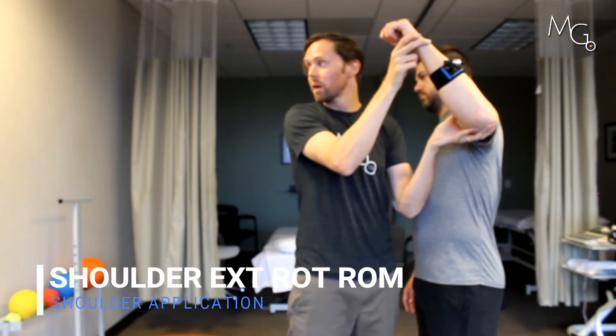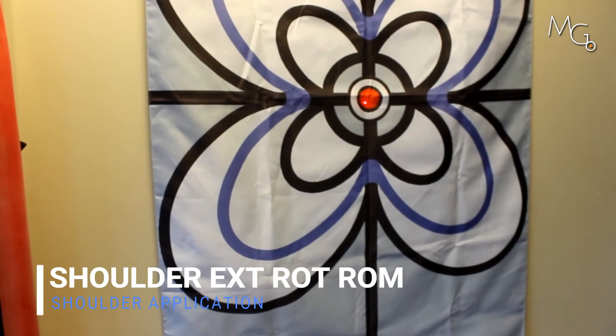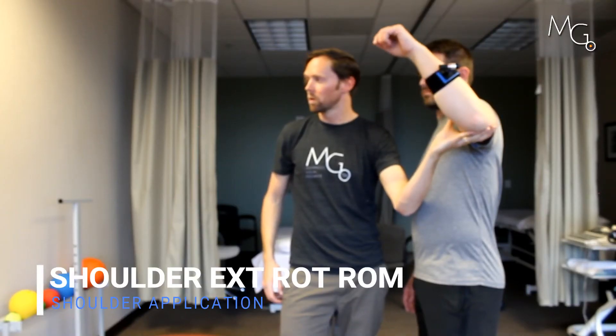Come back down. Chris, I want you to go back to that center line there — don't go further than it. Come back down. One more. Hold there.